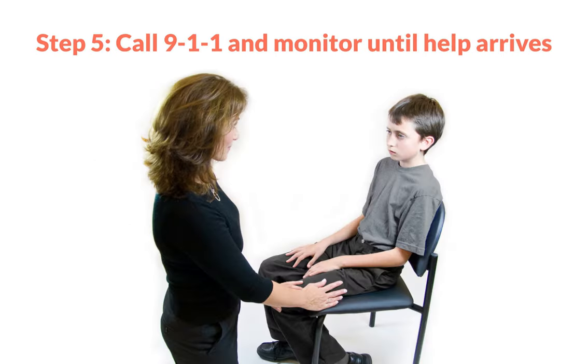Step 5. Call 911 or local emergency medical services and monitor the individual's symptoms until emergency medical services arrive. You should administer a second dose of epinephrine as early as 5 minutes after the first dose if symptoms have not improved.